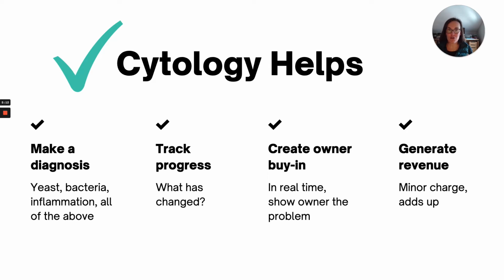But for your general pyoderma and your malassezia dermatitis, it's going to absolutely help you say, this is a bacterial pyoderma, versus looking at the lesion, where you're not always going to get it right. And then you could have a misdiagnosis and create this whole chain of treatments for this patient that are inaccurate. And that's absolutely something that we want to avoid.